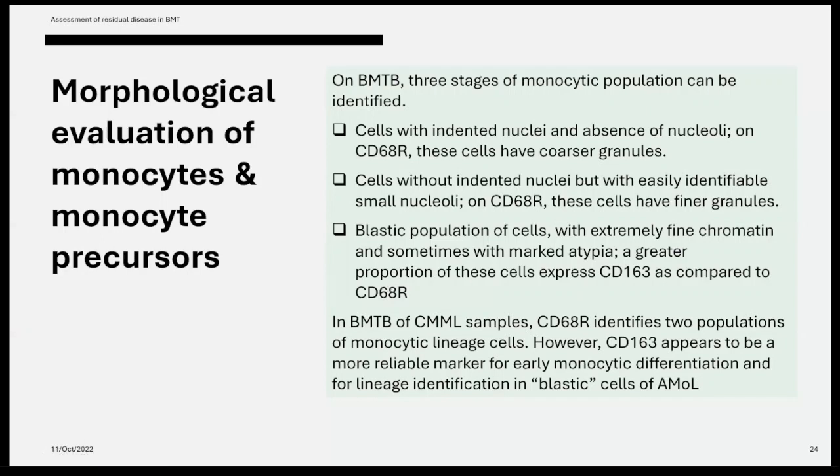Cells with indented nuclei, absence of nucleoli, CD68 positive. These cells have coarser granules. So this is one group of cells: CD68 positive, indented nuclei, no nucleoli, coarse granules.